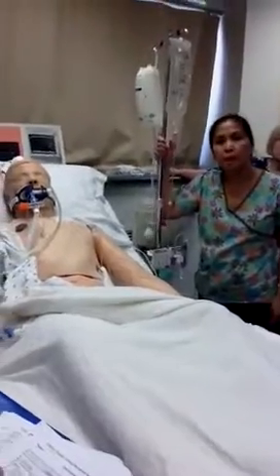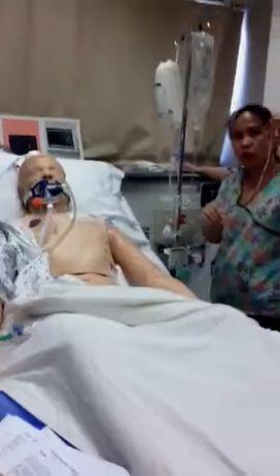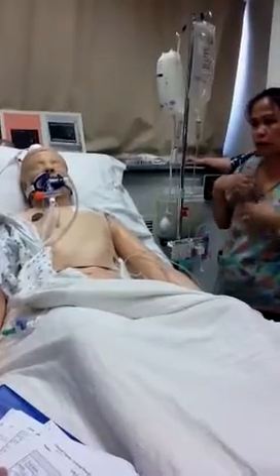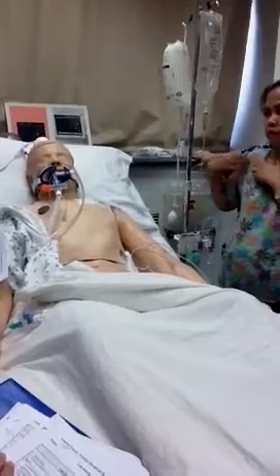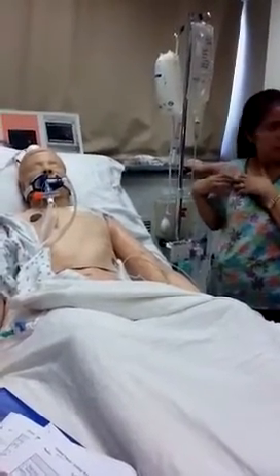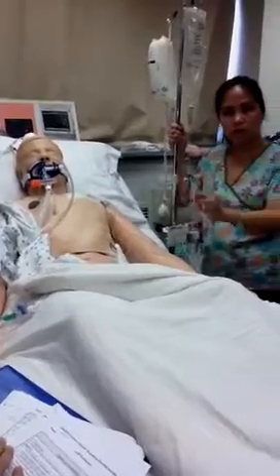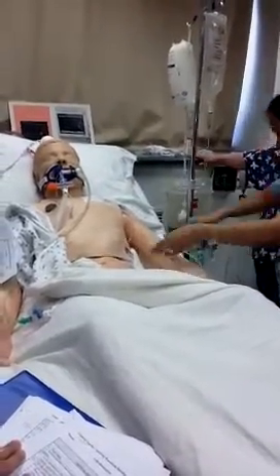Did you say that you level the central line too, or no? The CVP. You have one that you're actually transducing. And you're looking at what, when you do a central line, and I know you guys talk about preload, where are we measuring? Usually the preload, which is the right atrium. That's where you're measuring, just to see if the patient is fluid depleted or not. So this is where you measure. It's through here.